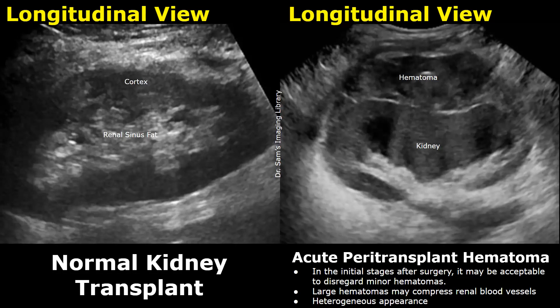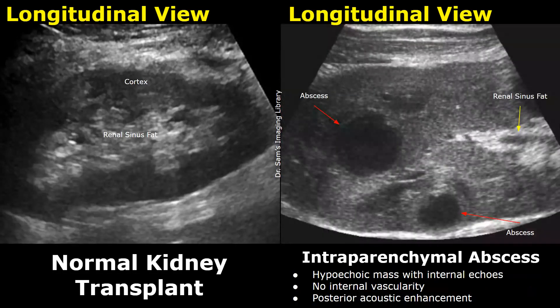Here is a case of intraparenchymal abscess. The abscess can appear as a hypoechoic mass with internal echoes. It will not have any internal vascularity, and it will also give posterior acoustic enhancement.